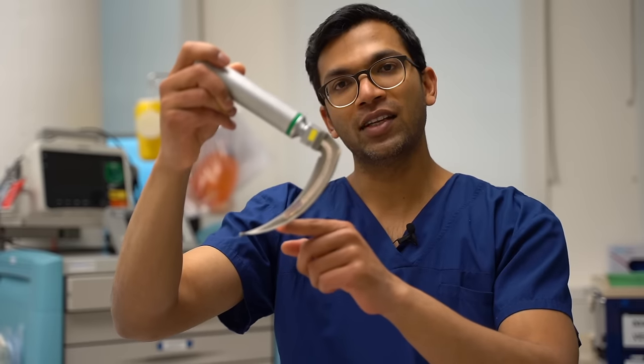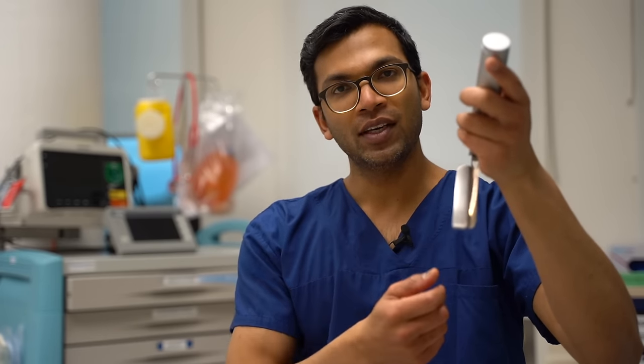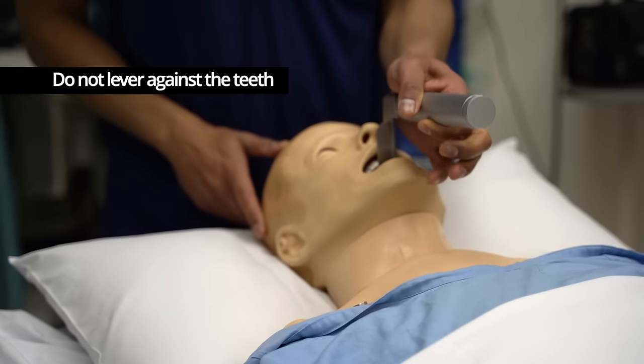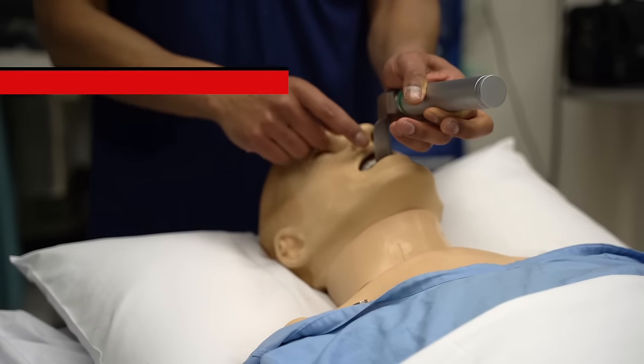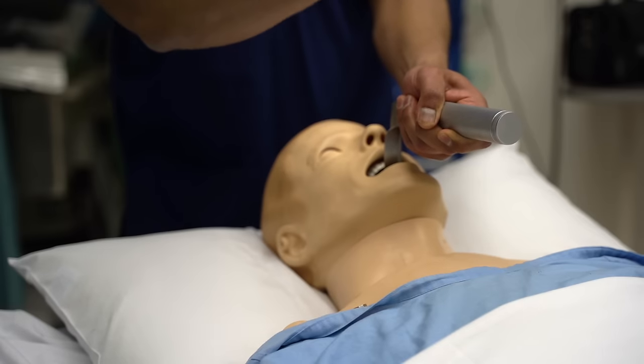Again, the tongue is the road down to the vallecula where this tip needs to be. After you've found the vallecula, the best thing to do to optimize your view is to do a lifting motion — not what people normally do naturally, which is tilting back. That's only going to lever against the teeth and won't provide any aperture down through the oral cavity to the trachea. What you need to do is lift towards the corner of the room — I get my trainees to look up at the corner of the room and literally pull there.